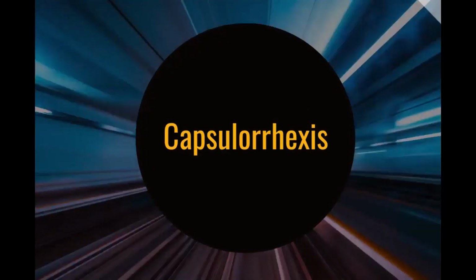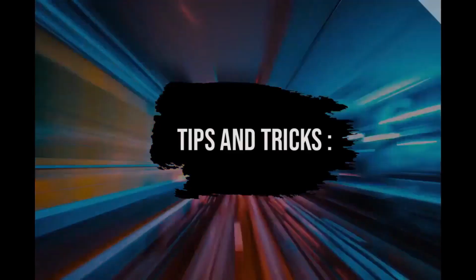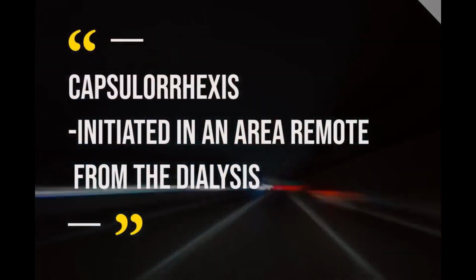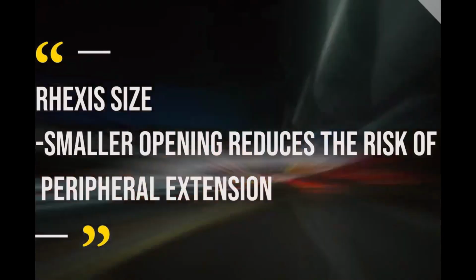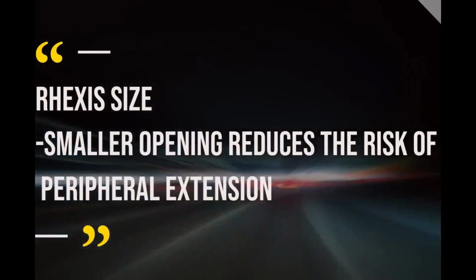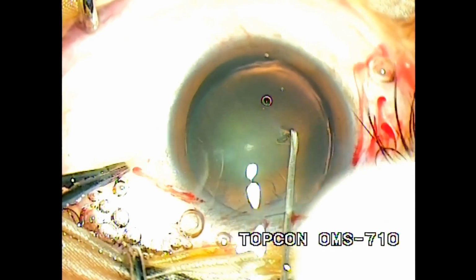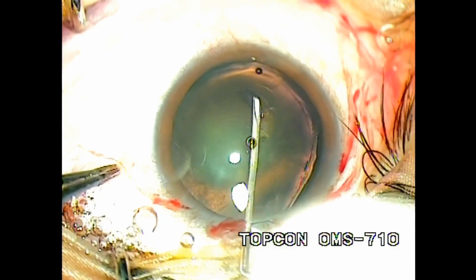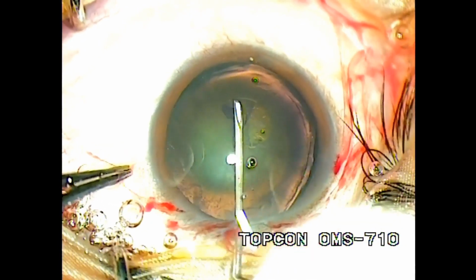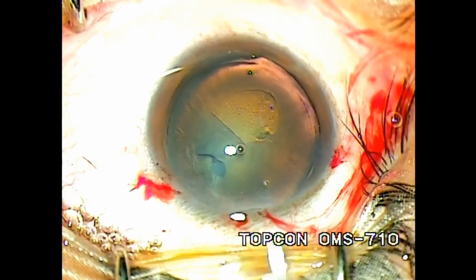Moving on to the capsular rhexis. The points to ponder, the tips and tricks of capsular rhexis, are: the initial flap should be initiated in an area away from the weak zonules. In severe cases, a bimanual technique with a second forceps can be used for sufficient countertraction. Usually, a smaller opening reduces the risk of peripheral extension, although a larger opening can be preferred to counteract the tendency of capsular contraction.